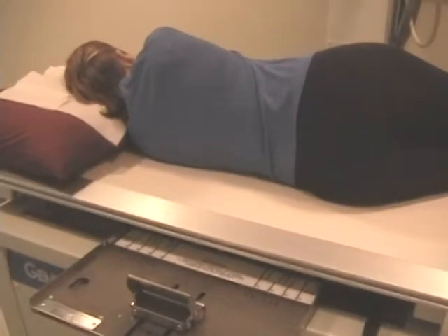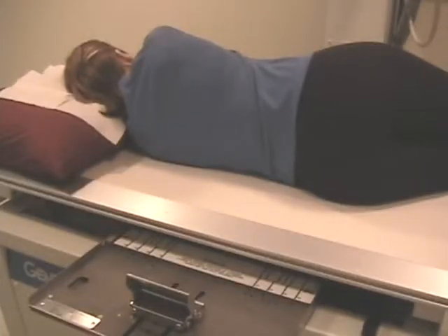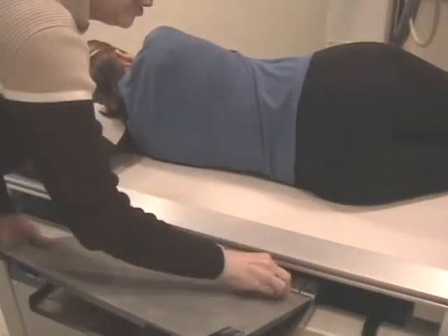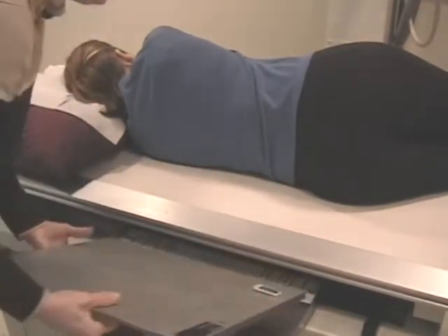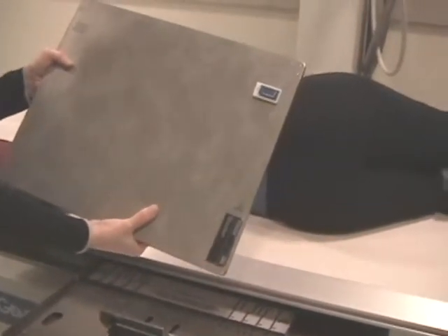I'm going to go back to a 14 by 17 cassette. And I'm going to use a left marker because she's on her left side. And I've put the left marker in a ways because I'm going to collimate.